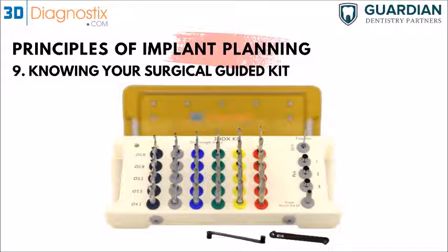We usually see a lot of surgical kits that have very long drills. So you would know that you wouldn't be able to use those drills far back in the molar sites. If you know that beforehand, then you would be able to at least figure out another way to place it, or have a guided template to use either those drills or other sets of drills that would not have that same problem.